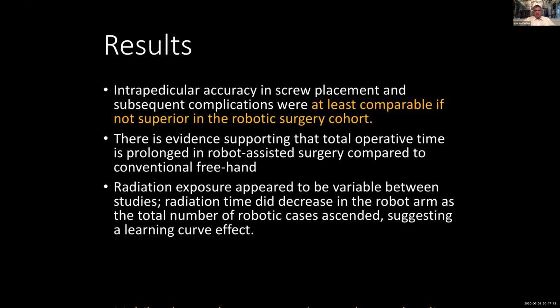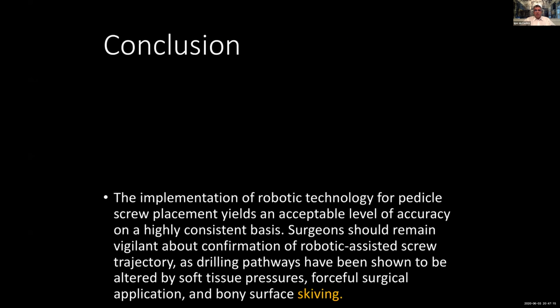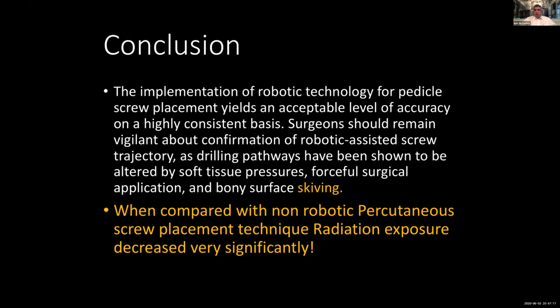There's already been talk about it. So the conclusion, again: it's nice to have it. It's very important to have it. And I think the technology is going to continue to progress. For me, the most important thing is that the less I expose my staff, my patient, and myself to radiation, the better, especially in the percutaneous surgery that we've been doing a lot.